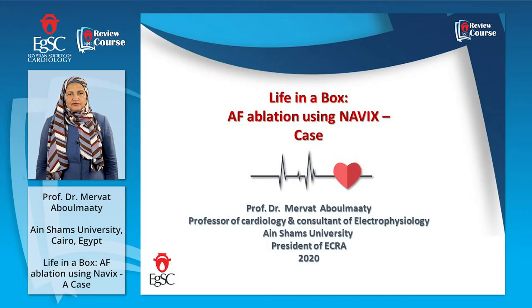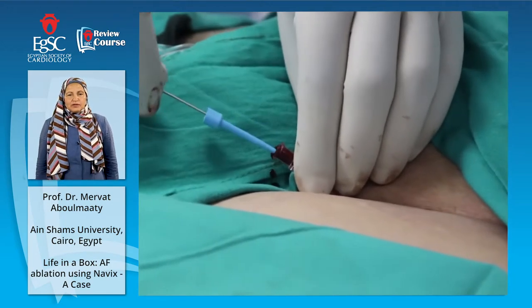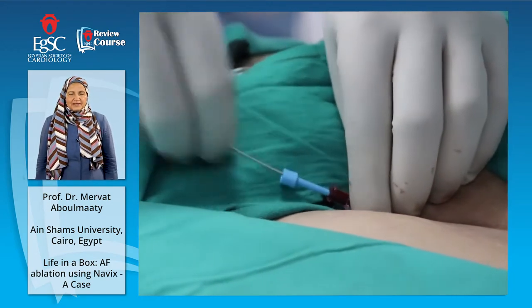This is Dr. Mervat Aboulmaaty, professor of cardiology, consultant in electrophysiology. I will show you live in a box of a case of AF ablation using Navix.